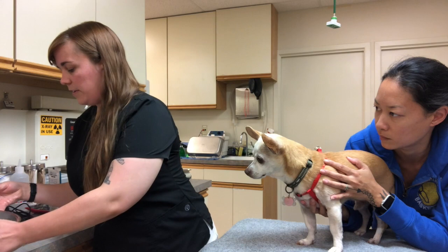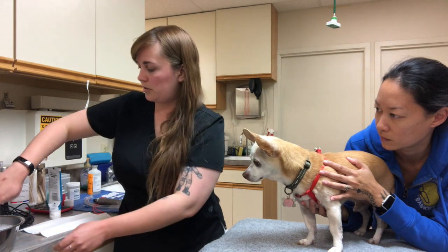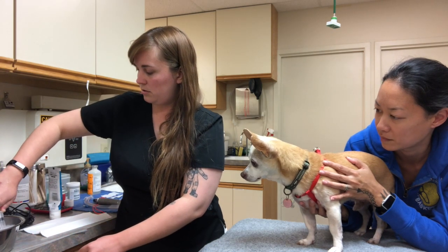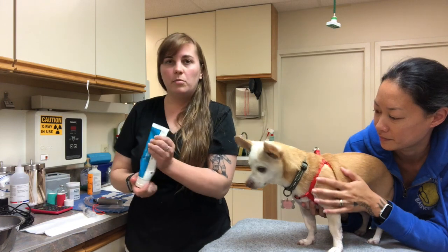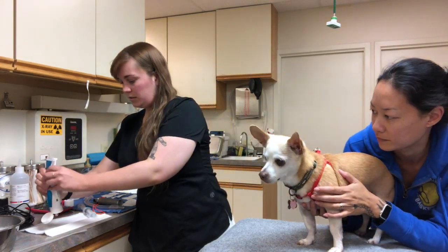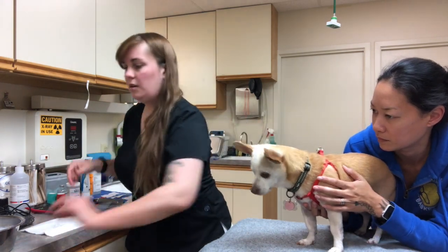I also have a syringe and a catheter. I'm going to pull up some soapy water in our syringe. Have that ready. And then I want to lube up our catheter for insertion into the anus. So I have some lube on a paper towel here.